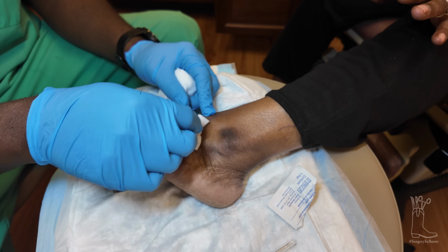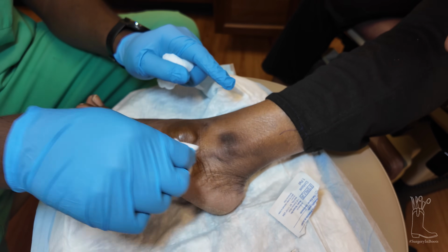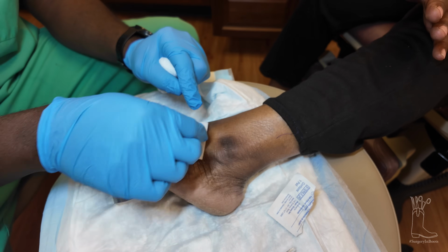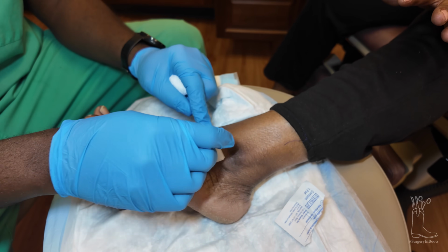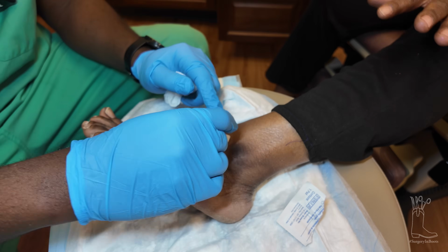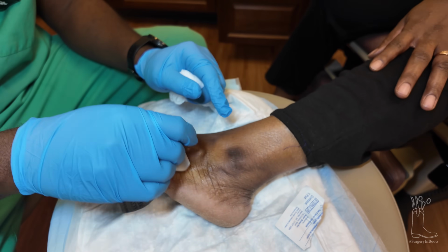What? Why are you frowning? Cause I don't know how it's going. You can tell me that, but it might sting a little bit. I ain't got to that part yet. I'm just wiping your little ashy foot off, make sure it's not dirty. Look, it's not dirty. It's just ashy. I know that. You wash your feet. You just don't put lotion on. No, it just that right there makes me not want to do nothing to it because it hurts. I know. All right, so a little bit of pain. Thank you. Just to numb it up.